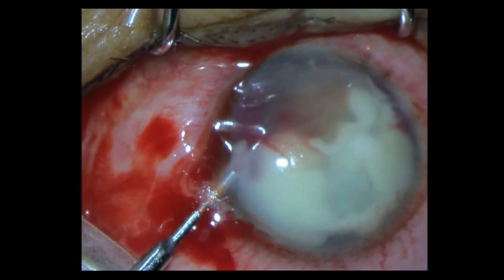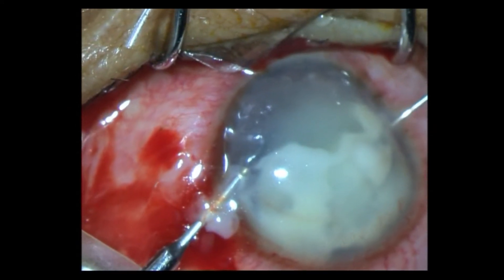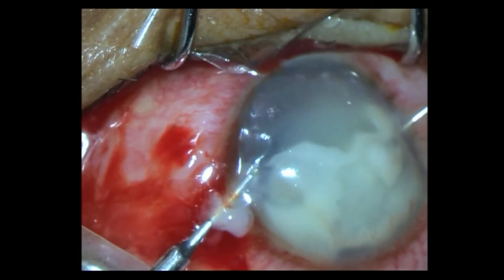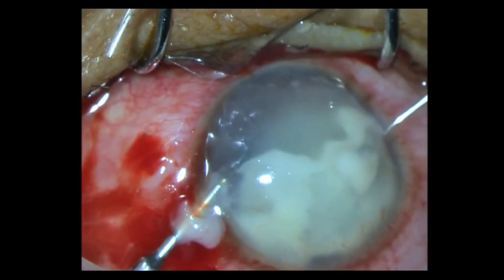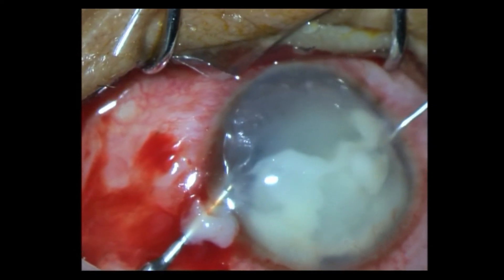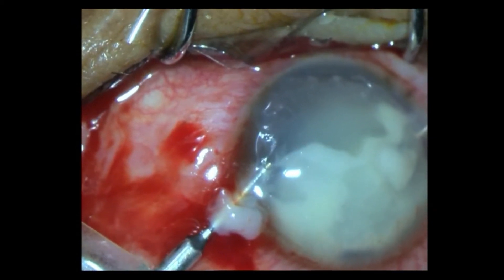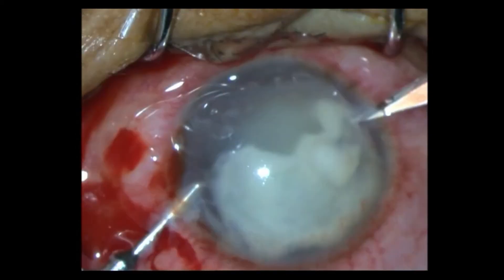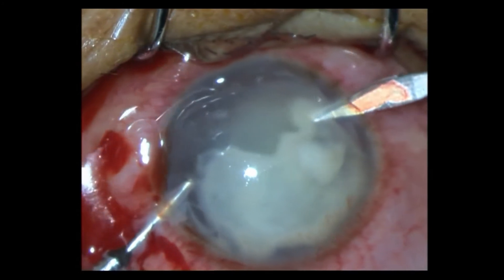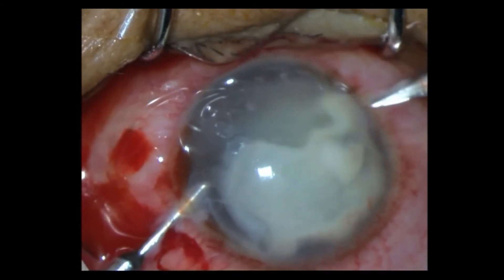I have opened up the infusion. As you can see, a little bit of the coagulum has come out — in fact from both the paracenteses. I am trying to depress the posterior lip of the other side and trying to evacuate, but the coagulum is so organized it's just not coming out. You can see how dense and fibrous it is.